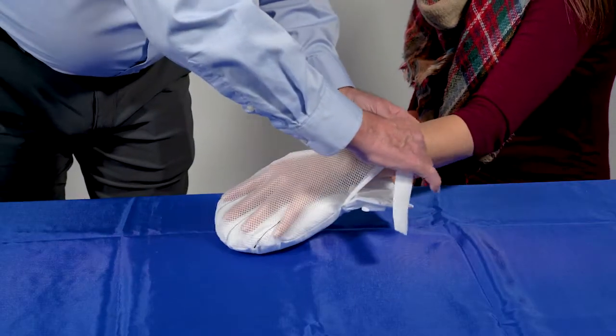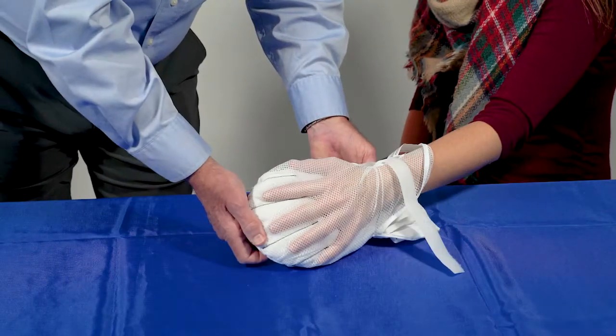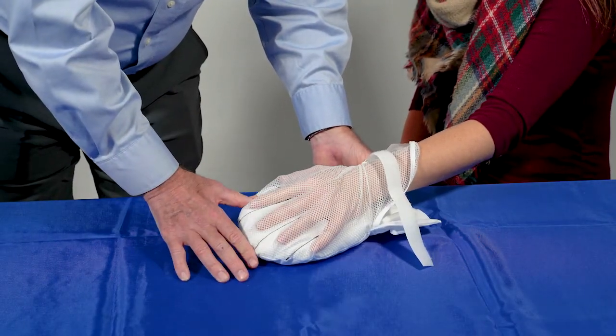Insert patient's hand inside the mitt palm down. Separate the patient's fingers so that each finger fits into its own slot.